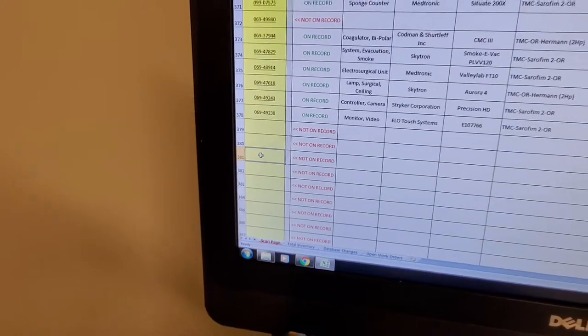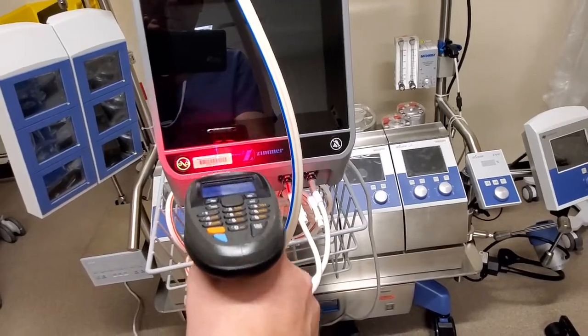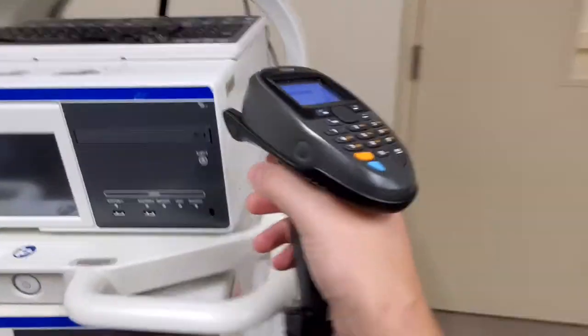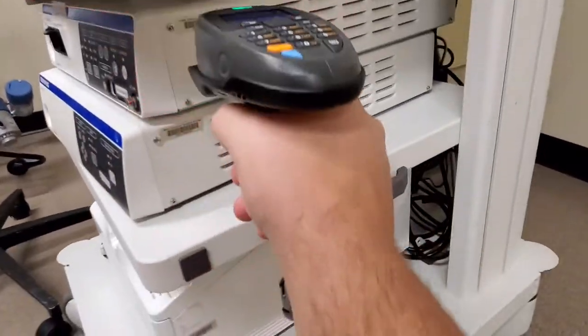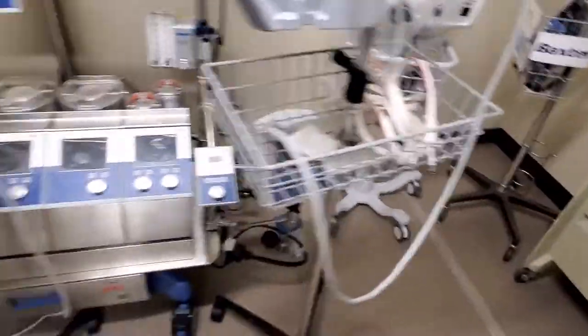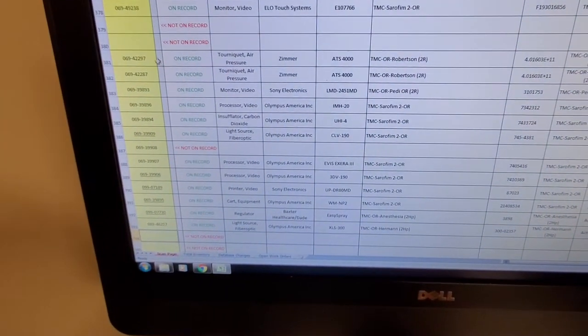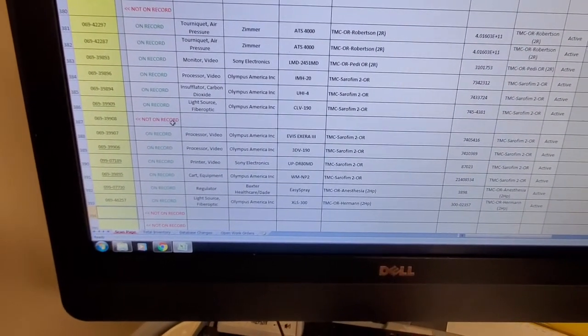I'm going to start down here and we're going to take the scan gun. Let's see how fast we can go through some items. All right, that's one video tower. Let's go over here — okay, that was quite a few. Let's take a look.